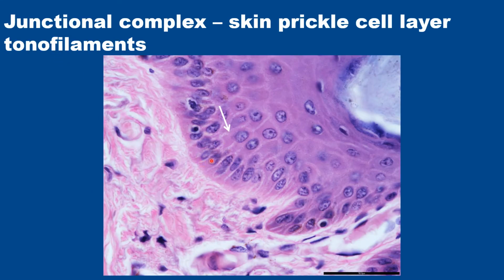This kind of structure you have already seen. This is the structure of the epidermis. On the right side the stratum corneum is there, and on the left side the other layers of the skin. There is the stratum basale with certain cells, probably the nucleus around a space. This is a melanocyte, and in the upper layer you can see there are spaces in between the cells with certain spine-like appearance. So this is the stratum spinosum.